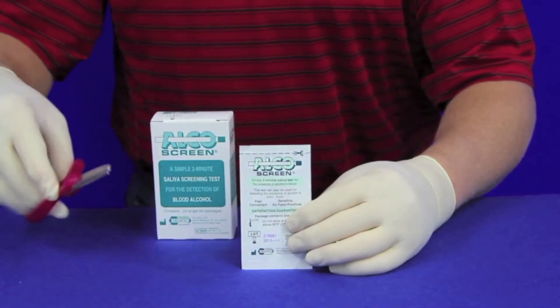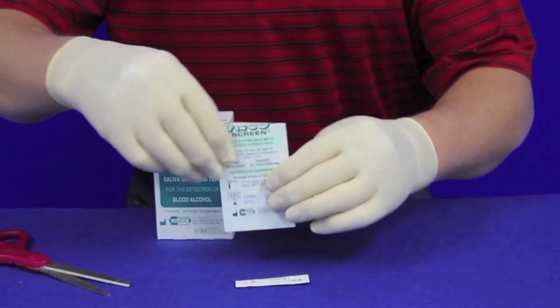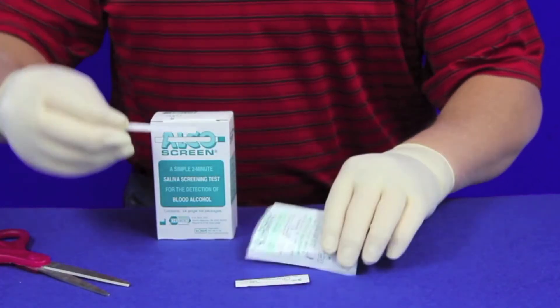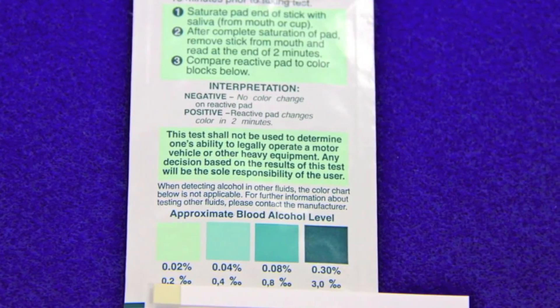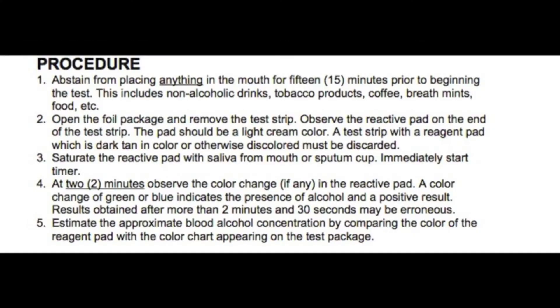Step 2. Open the foil package and remove the test strip. Observe the reactive pad on the end of the strip. The pad should be a light cream color. A test strip with the reagent pad which is dark tan in color or otherwise discolored must be discarded.